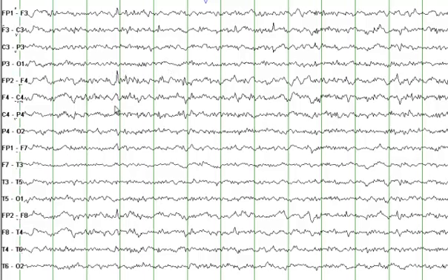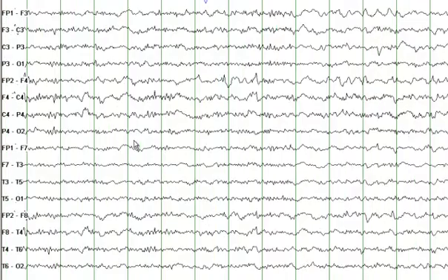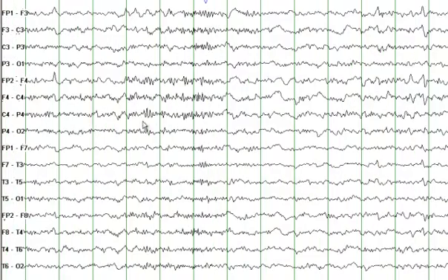Another nice example of a sharp wave with maximal amplitude at FP2. These are eye blink artifacts. You see that there is a higher amplitude on the right as compared to the left side. You also see some faster frequencies, and although these are present on both hemispheres, you see higher amplitude in the right hemisphere.